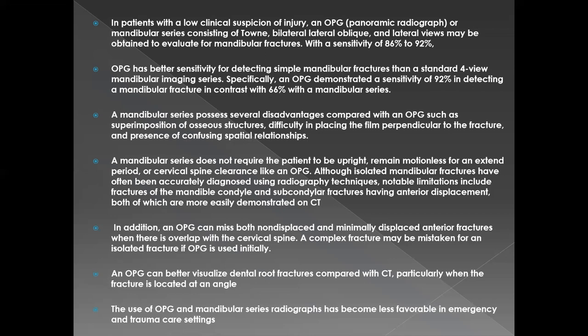Like I said, for an OPG, you have to put the patient upright, they have to remain motionless, and what if there is a cervical spine injury? So these are all things which can exclude the use of an OPG in an emergency setting. Similarly, for other X-rays, if you want to do a mandibular series, you'll have to do 4 X-rays. That's going to take time. Other than that, its sensitivity is less. So you might miss a fracture, even though you've done 4 X-rays, you still might miss a fracture.